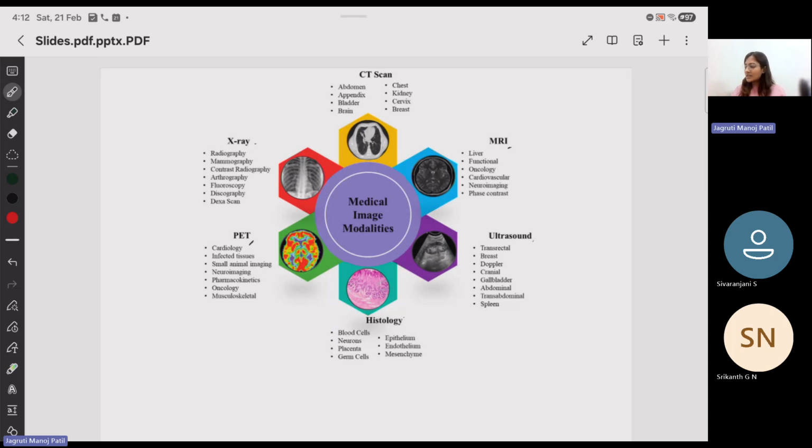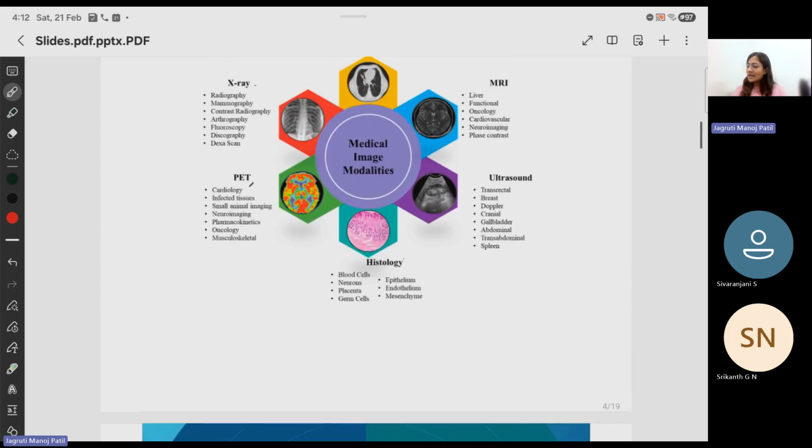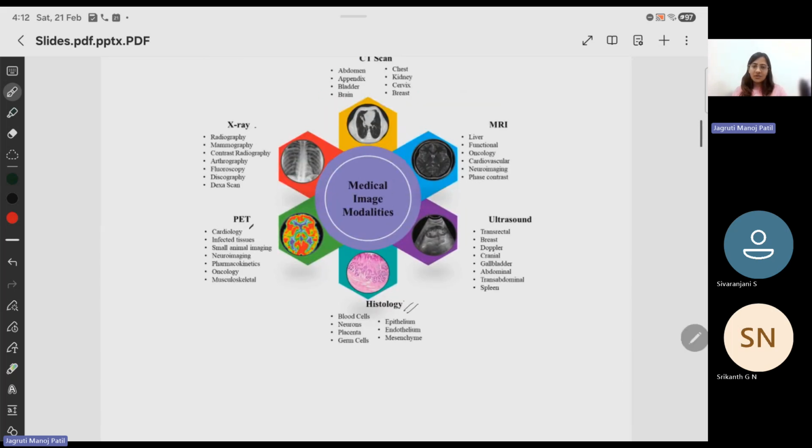And then there's this non-invasive, portable technology that has been followed for some years now, that's ultrasound, which I have been personally working in. So that's the medical imaging modality that I work in. Ultrasound nowadays is available for almost all imaging of our human body, and it's also much more inexpensive with respect to the rest that we are looking at. It's also non-ionizing.